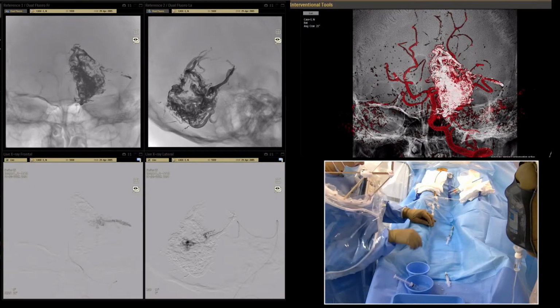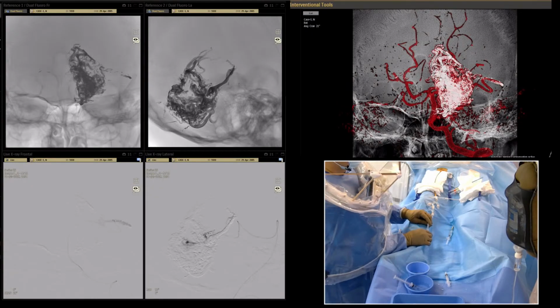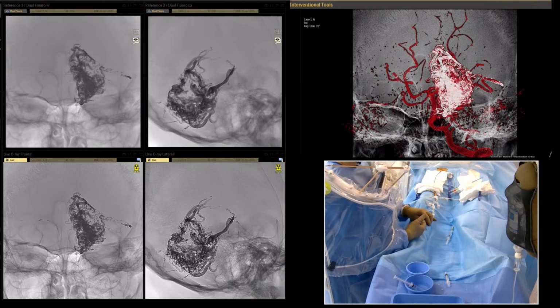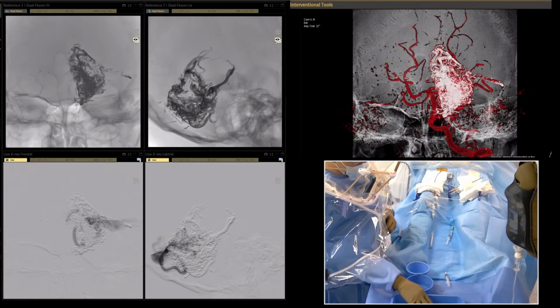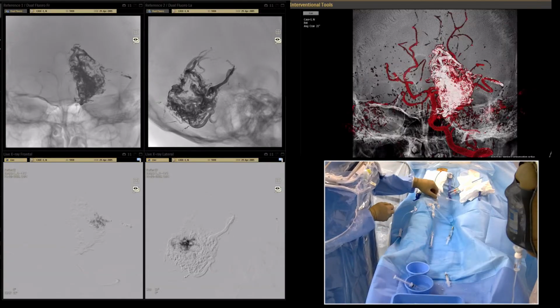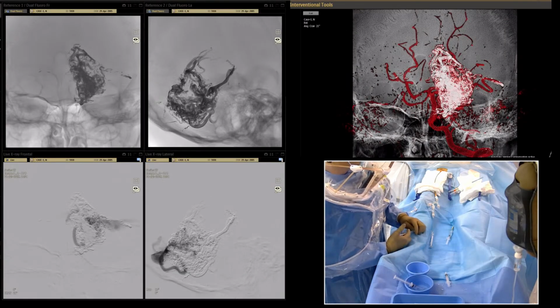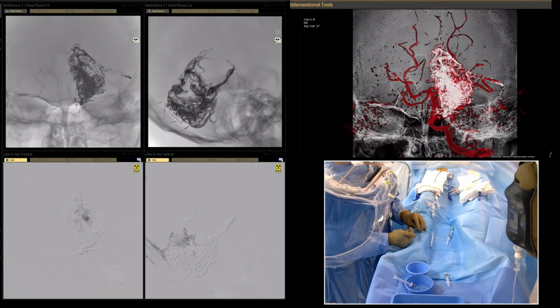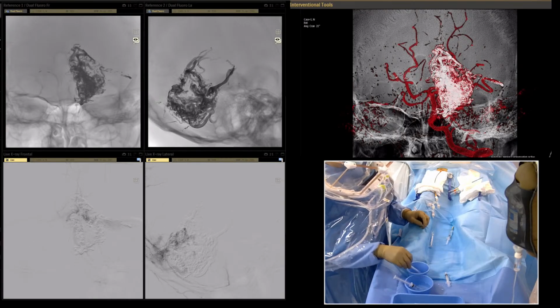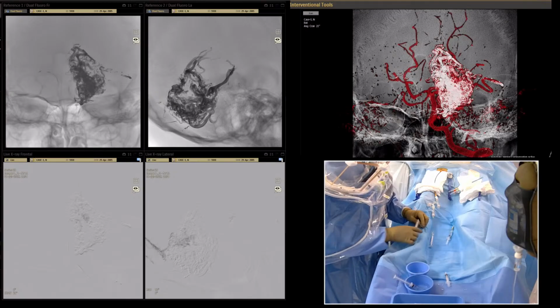Let's do the injection from the isolated Headway Duo. It's nice, huh? It's the so-called pressure cooker technique. Yes, we don't need to do so much reflux.